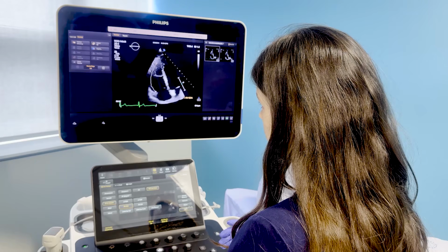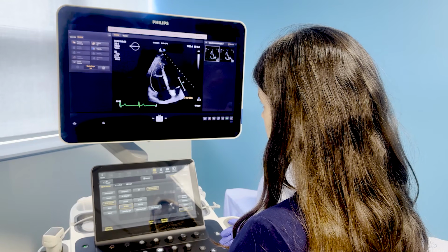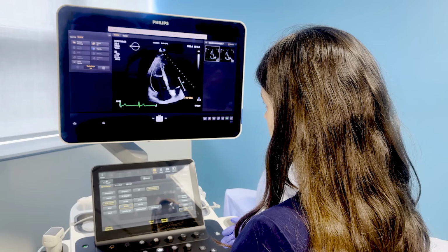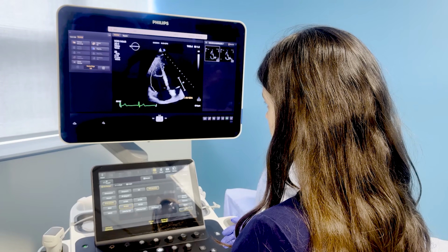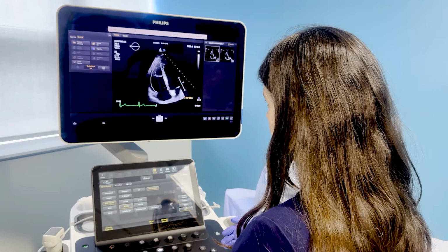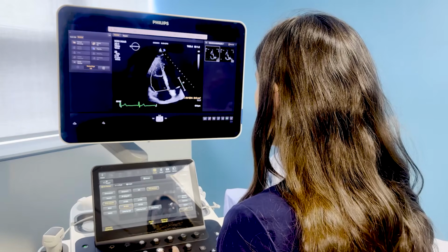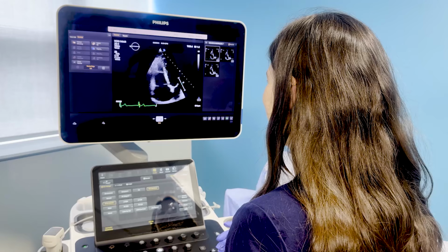And this is a very typical image that you may acquire of the right ventricle. As you can see, sometimes the walls are not well seen. This is probably a more typical example than a very well visualized right ventricle, which is not really everyday practice. So thanks for showing us this in a more challenging patient.